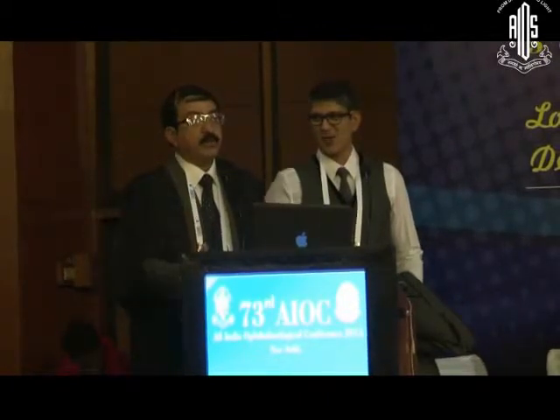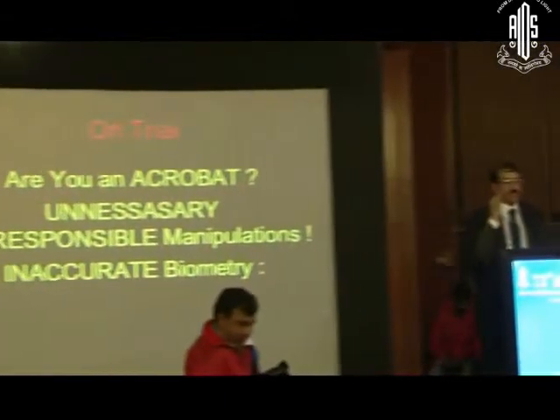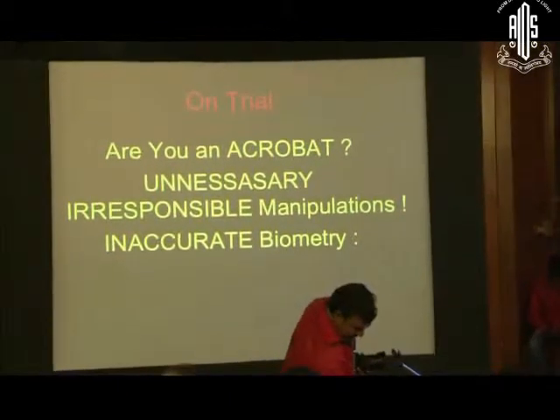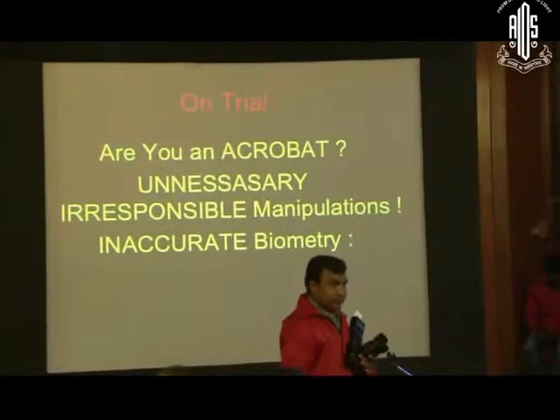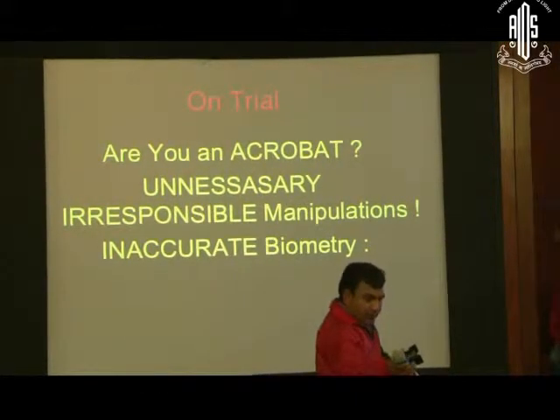What about the biometry? How can you get an accurate biometry in this patient? The shift of the ICL, the position of the ICL, can anyone ever determine this?